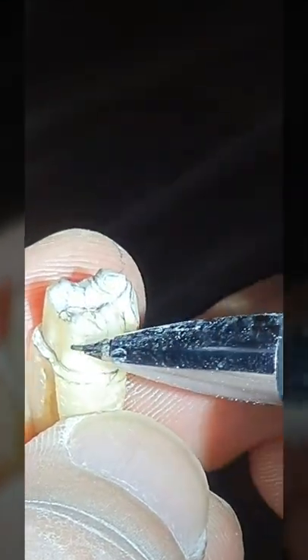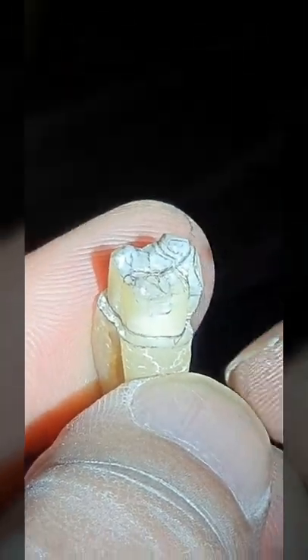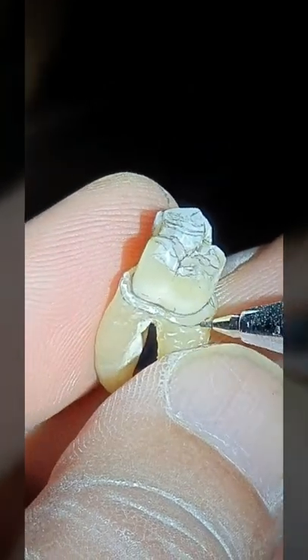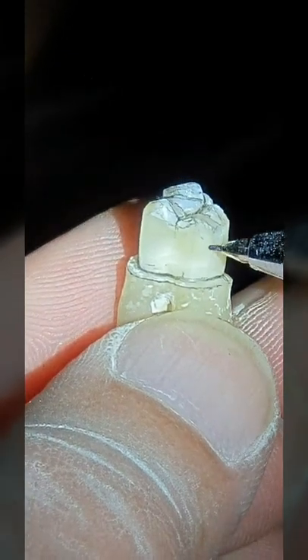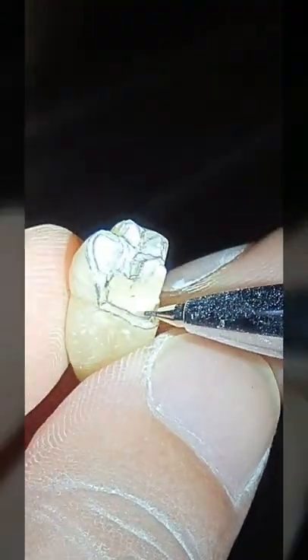The walls on the facial and the lingual have to be parallel with slight convergence to make sure that the prosthesis goes down in and out. The margins have to be very even, not only in depth but also in surface. They have to be smooth. Now the distal and the mesial are also convergent, so both of these are convergent. Facial and lingual are convergent.